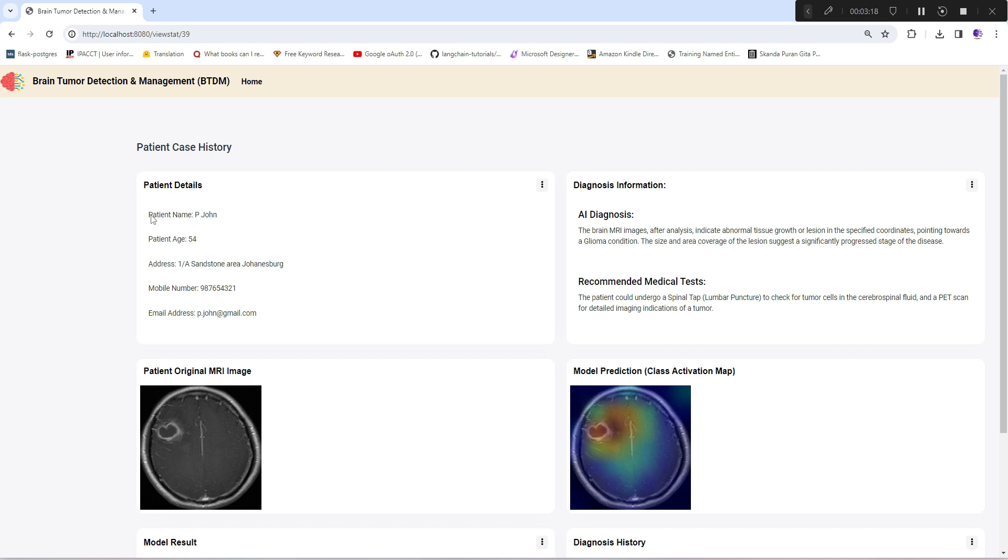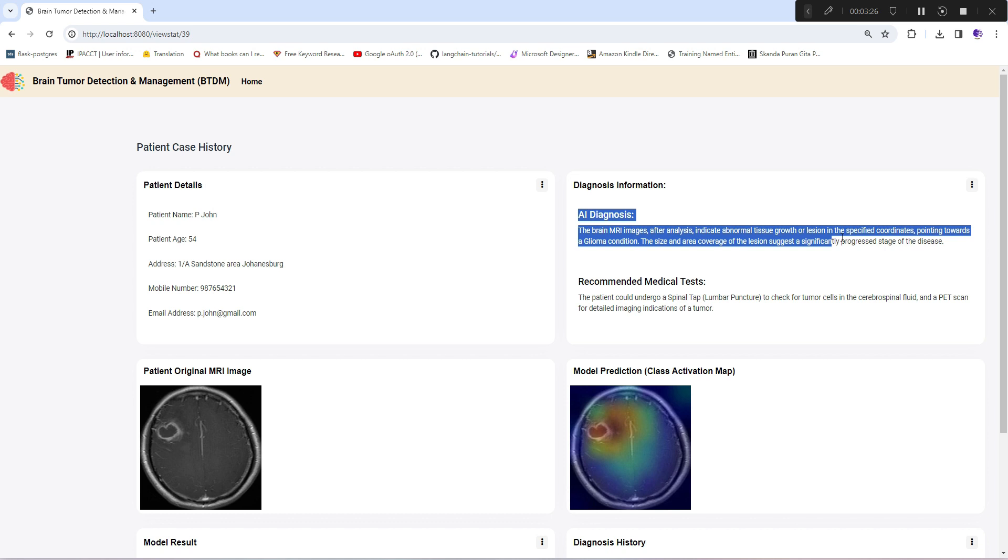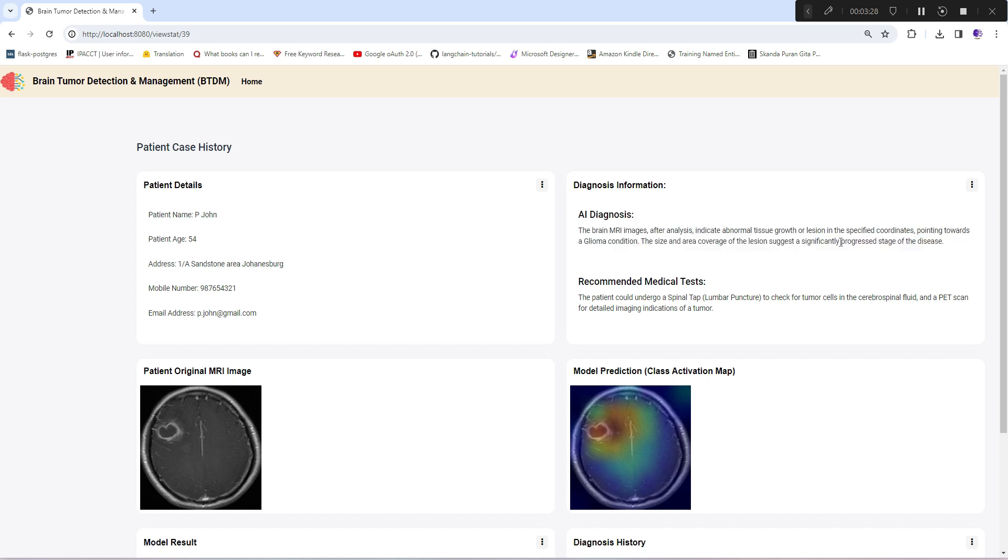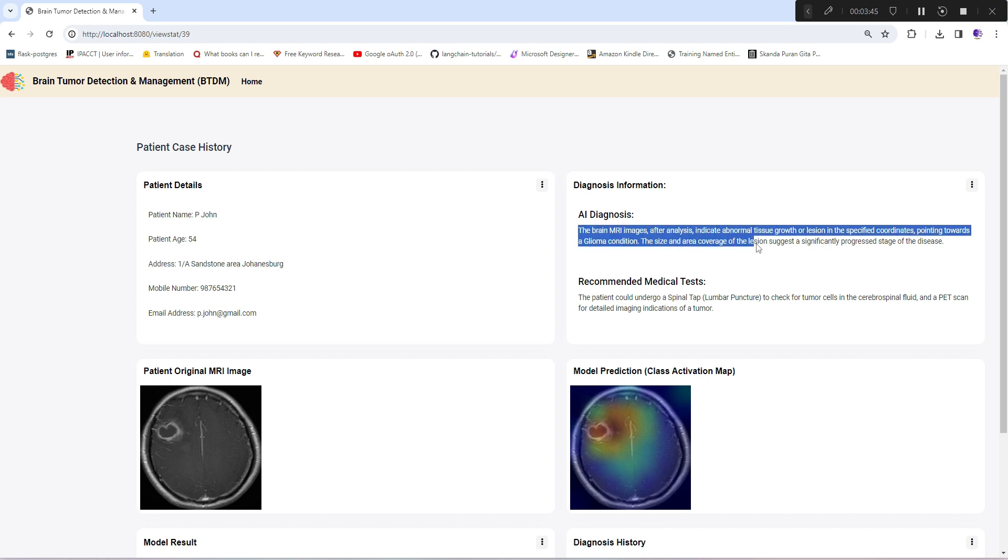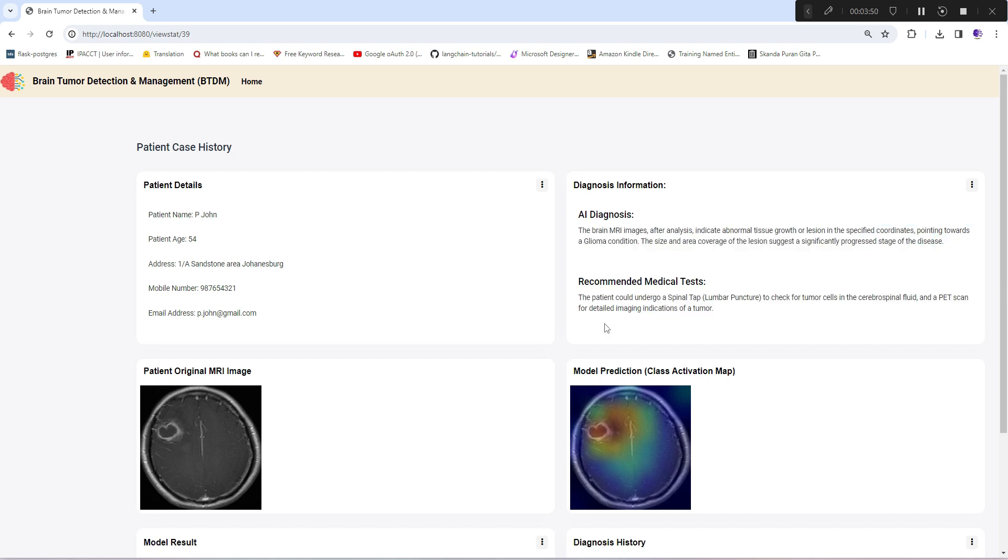If she wants to view a particular case in more detail, patient details are visible here. This is the diagnosis information section where AI diagnosis is directly coming from GPT-4 model. We've given the input as what our computer vision model is seeing in terms of heat map and the model's prediction, and the generative AI model is generating this diagnosis along with recommended medical tests.